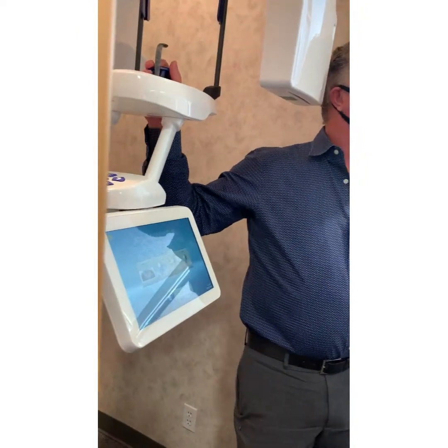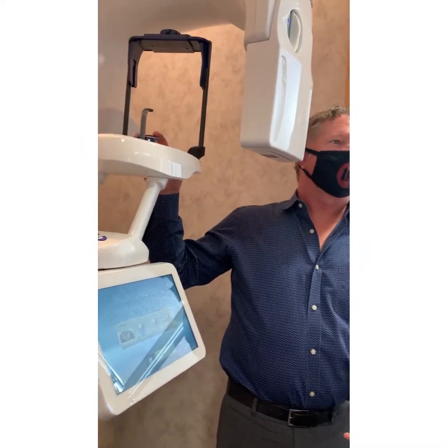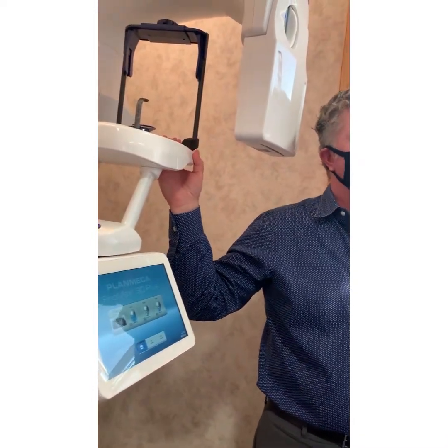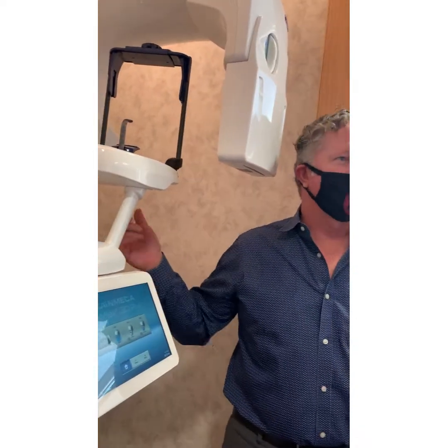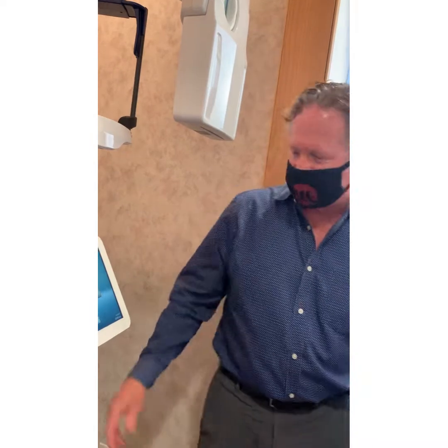There are always people outside the normal demographic. I've taken some pretty big noggins, one that I didn't think would fit in the chamber of an M11. He was able to squeeze his head in there and everything was okay. I always work those CDA, MOM, Mission of Mercy meetings, and I pull 400-pound people out of their Rascals and get good images with the ProMax. So I'm going to give you the idea of how it works with the ideal. Most people come into it like this, right? So we've got to put a chair here.